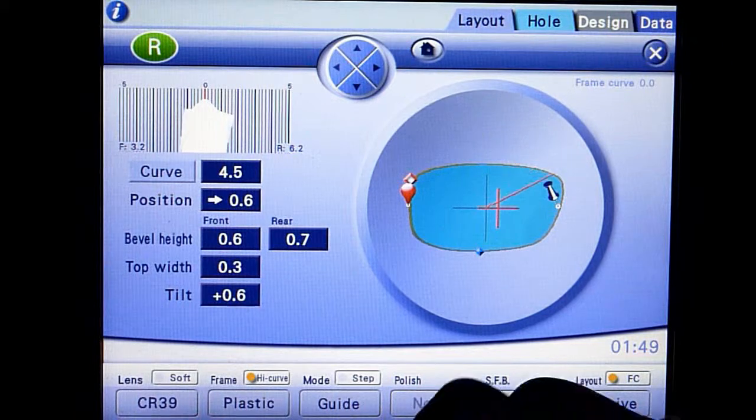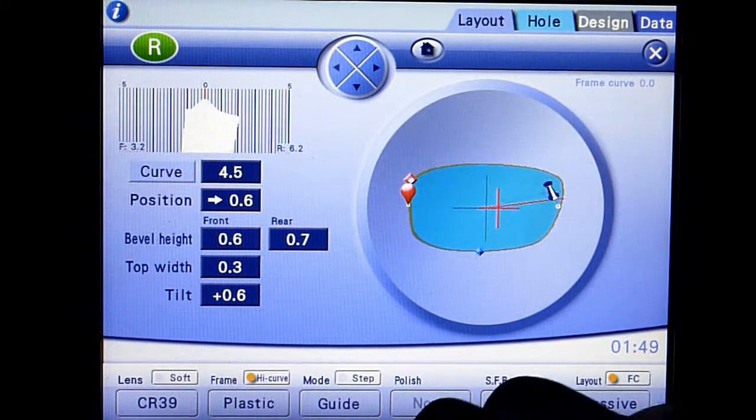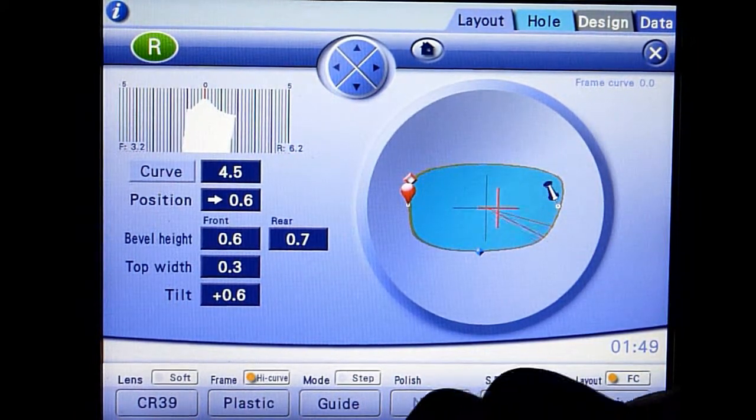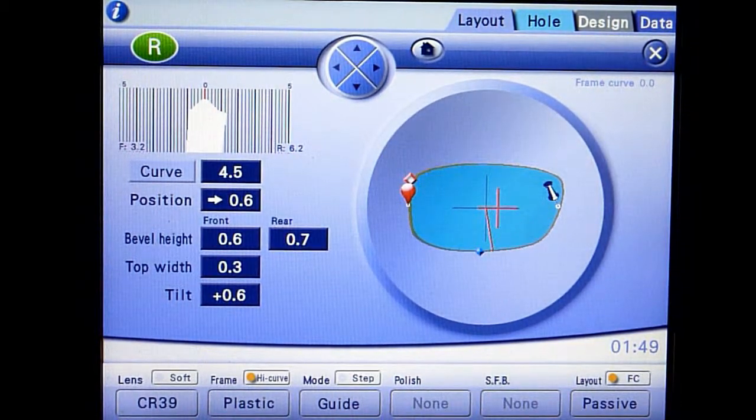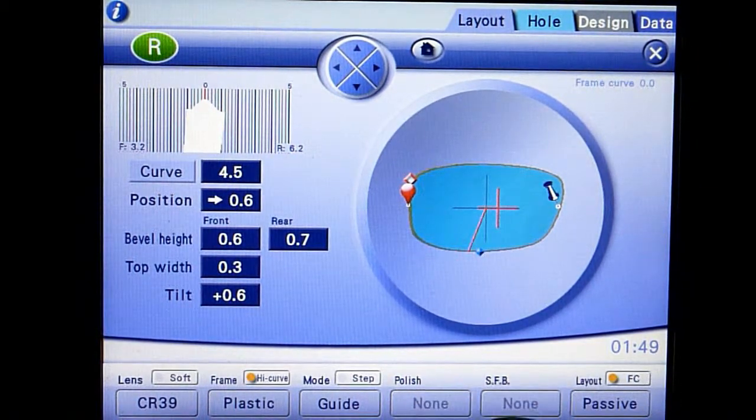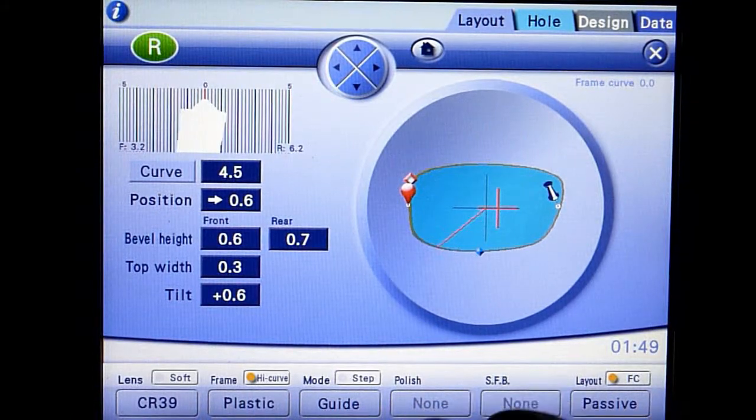Carefully review the bevel placement using the jog dial again. Press start to complete the edging process.